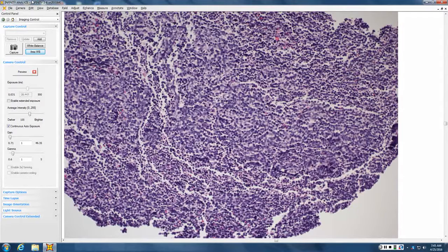The one that's in a trabecular pattern in skin with a smudgy chromatin pattern is Merkel. But this also has a smudgy chromatin pattern and has small blue cells. It's not particularly a trabecular pattern, which is like a parallel wall or parallel row pattern.